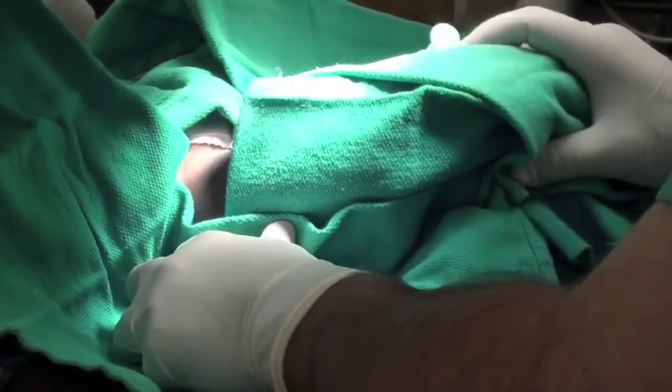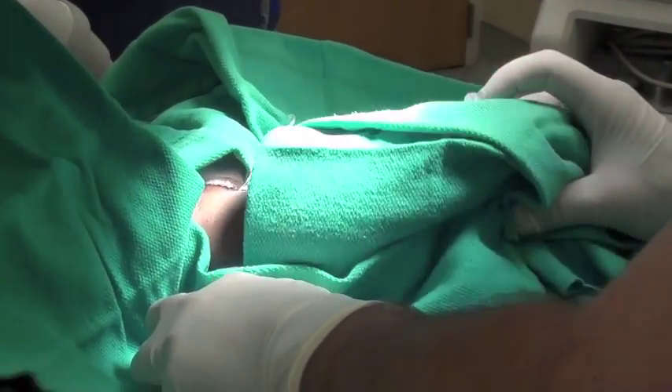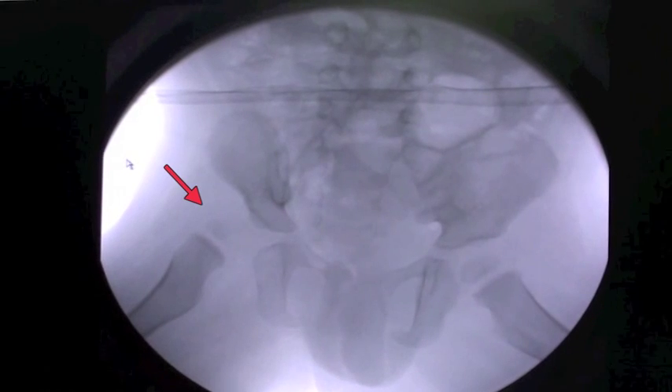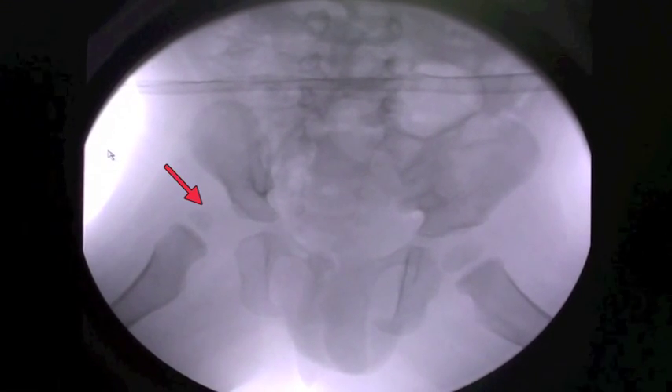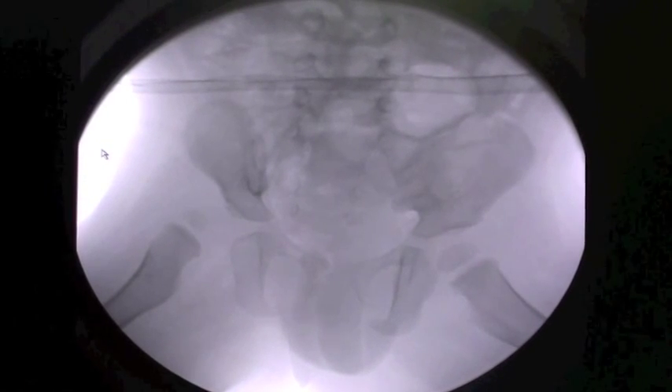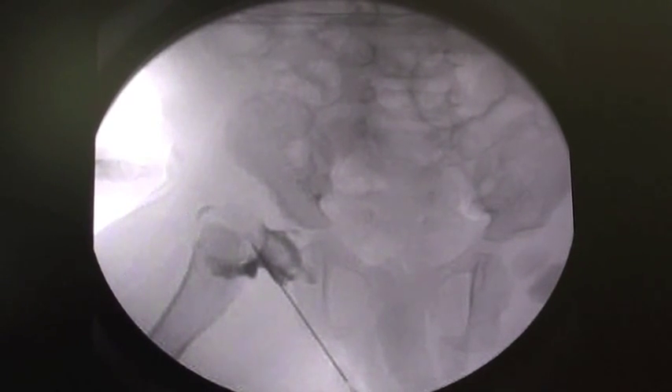This is the dye going into the hip joint after it's draped out. Here's the x-ray without the hip in the joint. This is with the dye in place — the hip's out of the joint.